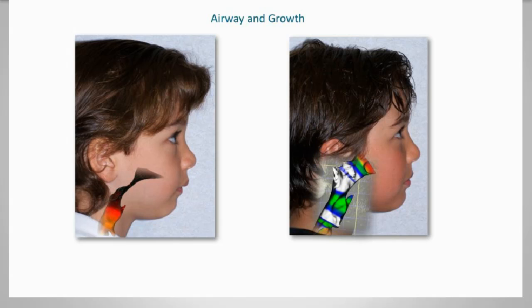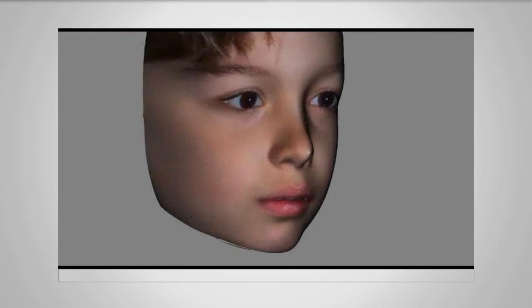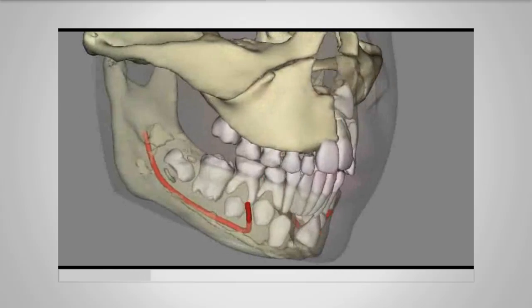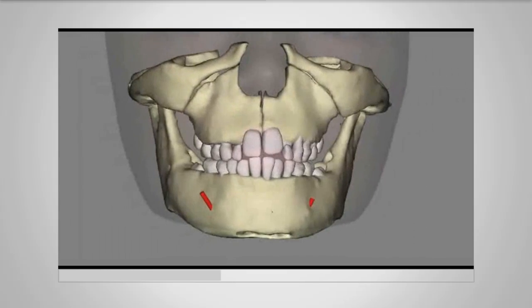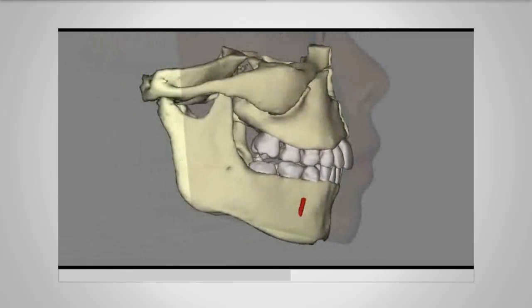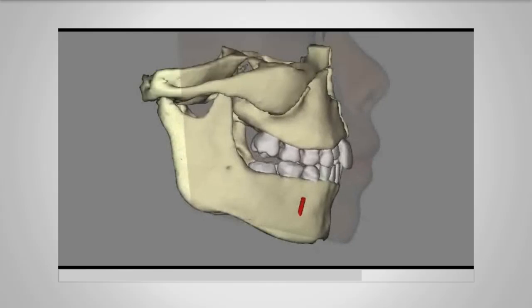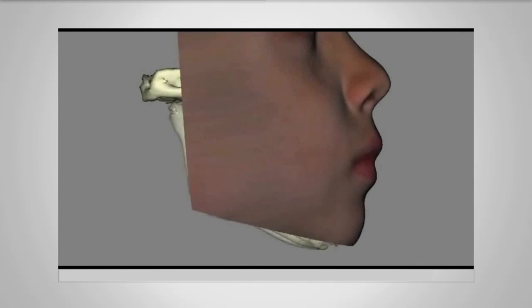So, this is a simulation of this original scan of what I think happened. I think what happened here is we agitated those maxillofacial sutures. Of course, removing the adenoids was first and most important. And expansion treatment is so easy to do on these kids. By agitating and stimulating these craniofacial sutures, that maxilla gets released and can come forward again. And that maxilla needs to be wider, significantly wider than the mandibular arch for that mandible to come forward.